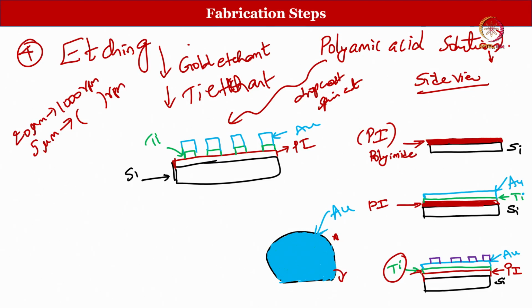Let us say according to that RPM, x RPM, we are going to spin coat, and then the layer will be formed all over, and we do 80 degree, 250 degree and all those things, right. Are you getting it?